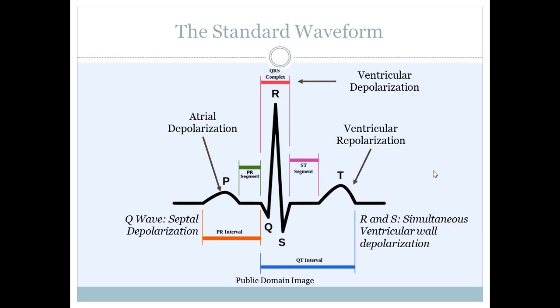There's also, in some rare cases, an additional U wave. No one is entirely sure what the U wave is, and it only shows up in rare cases. We will not discuss the U wave too much in this lecture. If it comes up in a future lecture, that will probably be more appropriate discussion for that time.